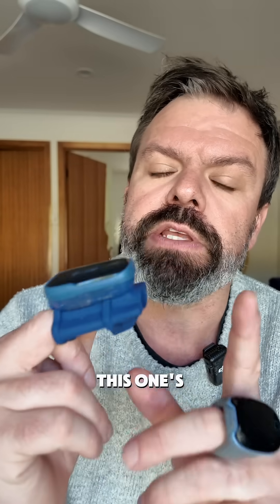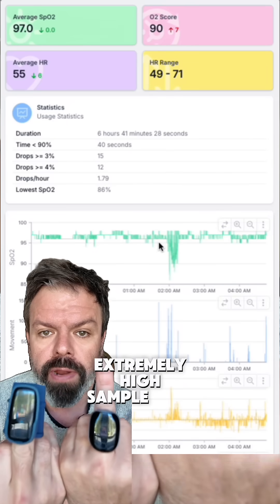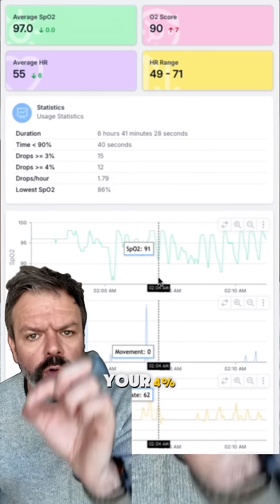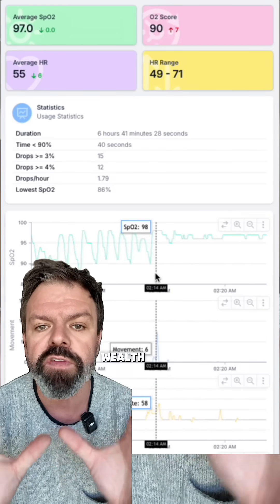This one here is an OxyFit — about 70 bucks maybe. This one here is an O2 Ring, a few different models, maybe 150 to 200 bucks. They've got an extremely high sample rate. They're medical-grade pulse oximeters. They measure your blood oxygen drops — your 3%, your 4% — your average oxygen, your pulse rate, your movement. A wealth of information.